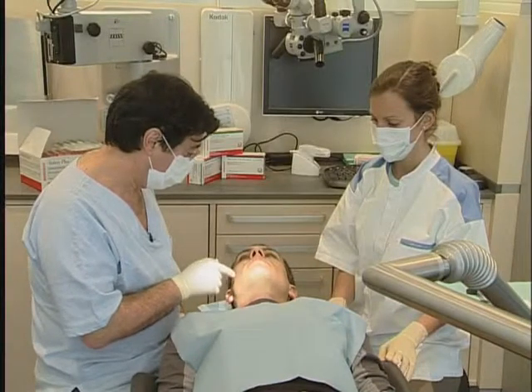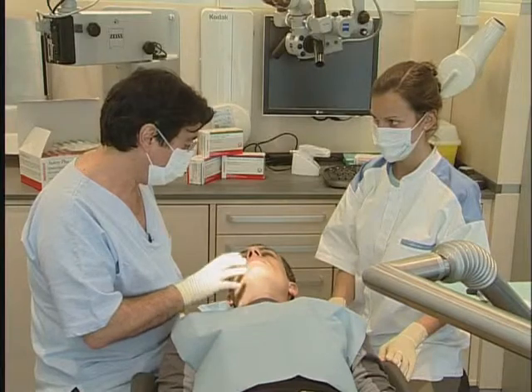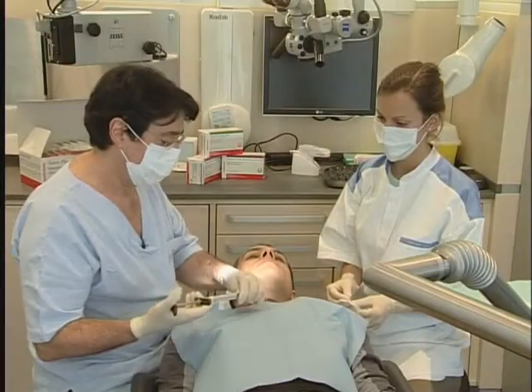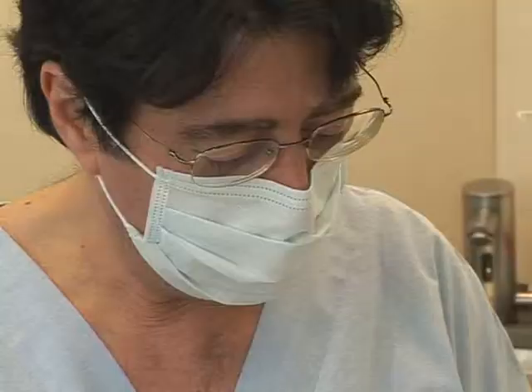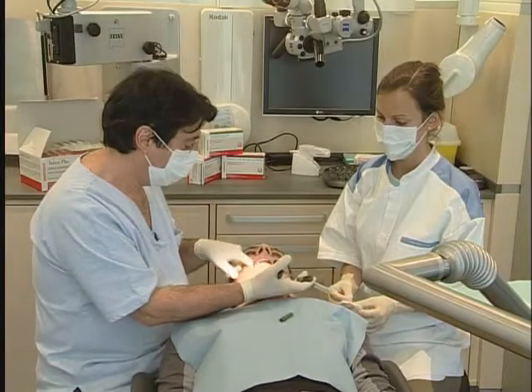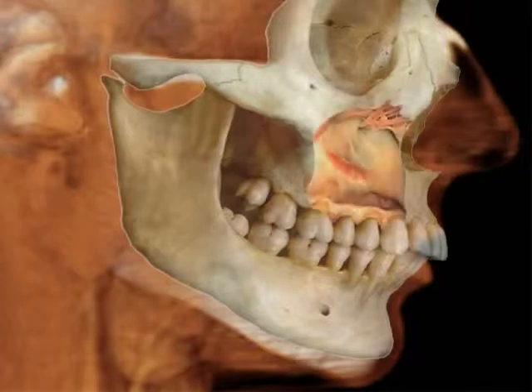Amazing enough, maxillary blocks are little used, even though they are easy to perform and avoid having to give a number of injections when working on several adjacent teeth. Maxillary block anesthesia for the canine and incisor area can be obtained in the standard manner by giving a high buccal injection at the level of the canine fossa, where the anterior-superior and middle alveolar nerves cross the thin-walled bone.